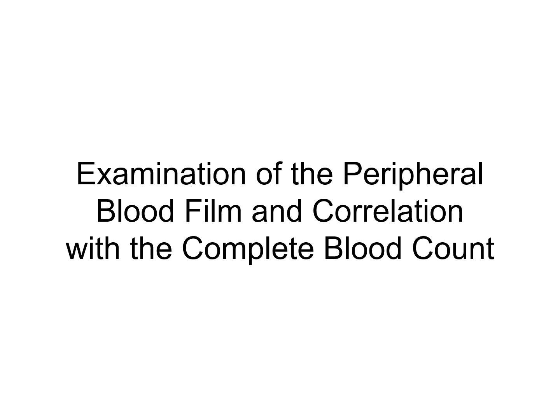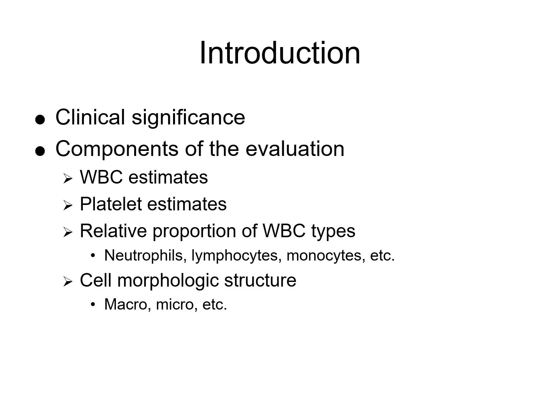Examination of the peripheral blood film in correlation with the complete blood count. So the peripheral blood examination is a diagnostic tool that provides important information about the patient's hematologic status. It can help identify infections, inflammation, hematologic disorders, and can help guide clinical management.